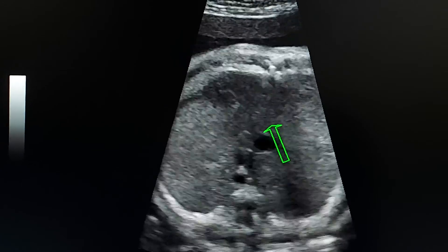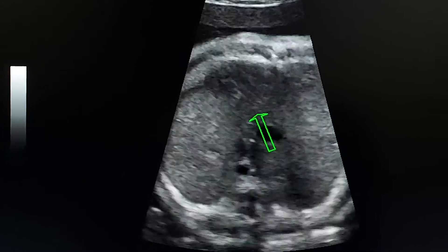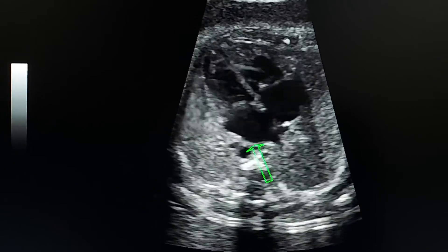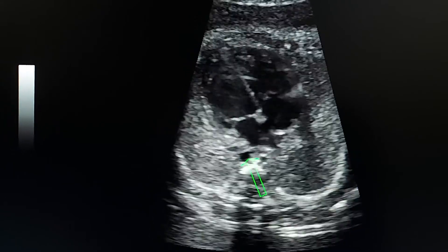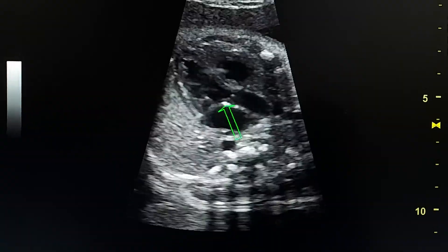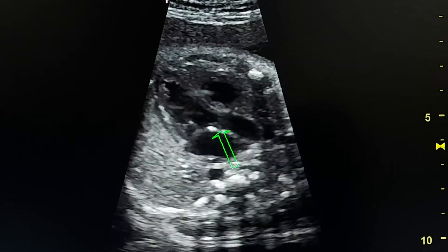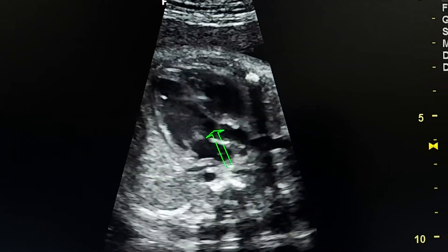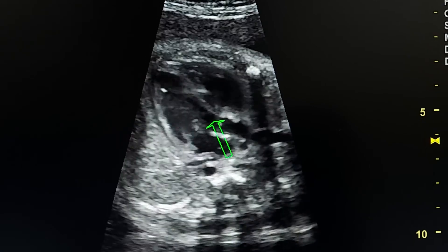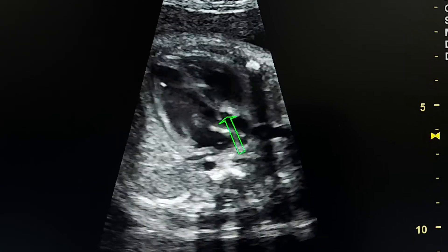This is the foramen ovale in the inter-atrial septum. This is the descending aorta. This section shows the LVOT — left ventricular outlet.